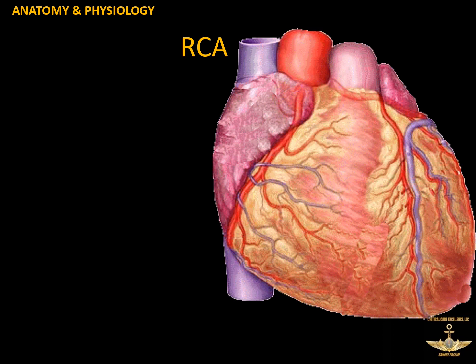And the first one we're going to look at is our right coronary artery, the RCA. And when I think about 12-lead EKG, everything really kind of goes back to that, because as we assess somebody for occlusive disorders like a STEMI, we think a lot about what's wrong with the areas which are affected by the vessel. So people tend to think of EKGs or STEMIs in terms of this is an anterior STEMI or a lateral or an inferior or whatever.